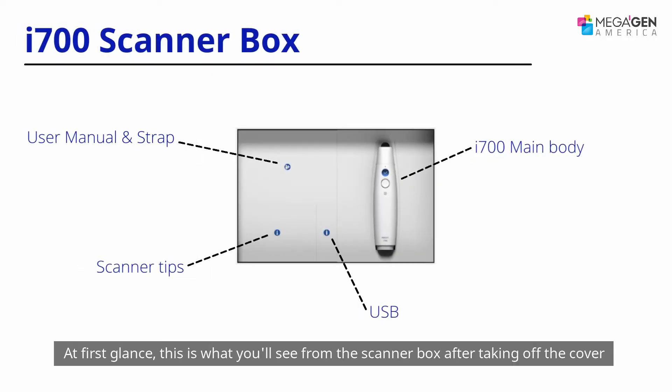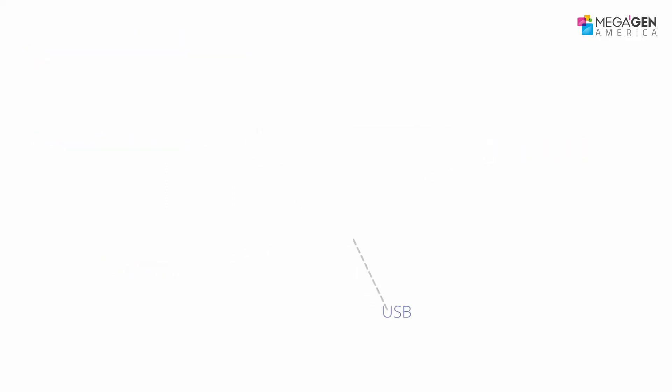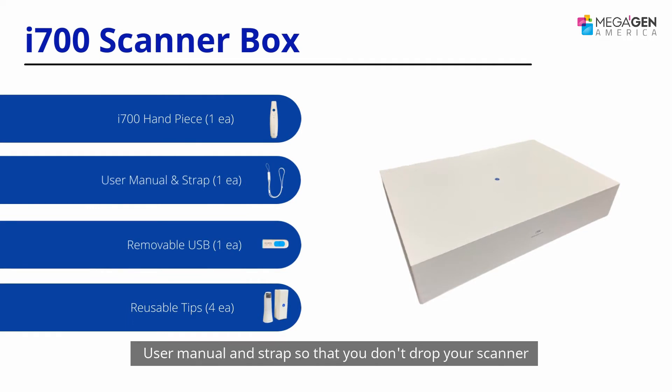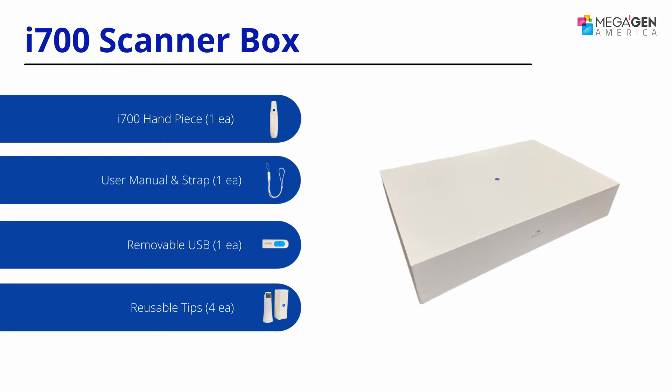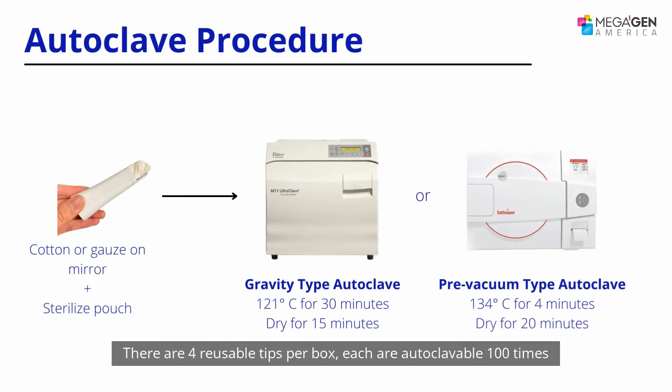After taking off the cover, you'll see your i700 handpiece, user manual, and strap so that you don't drop your scanner. There is a removable USB to download your Medit Link software. Additionally, if you do have internet, you can go to meditlink.com to download the latest version of the Medit Link software.